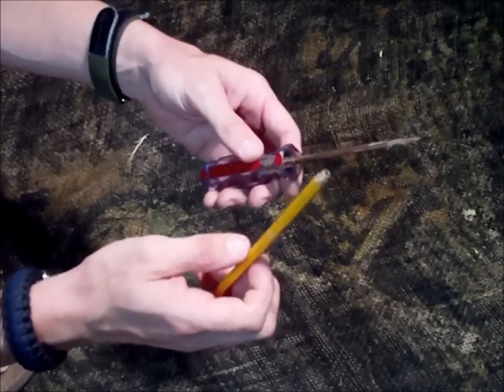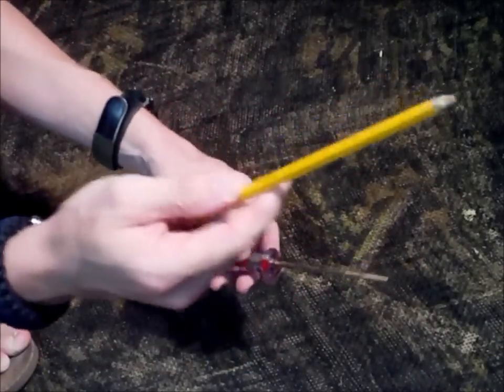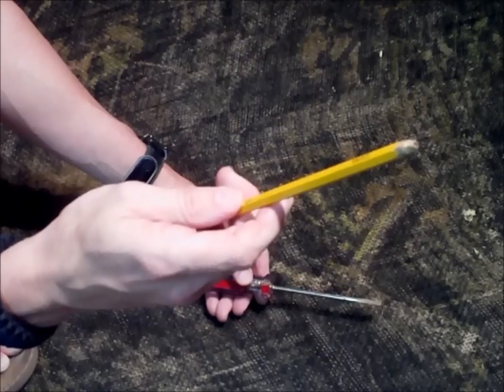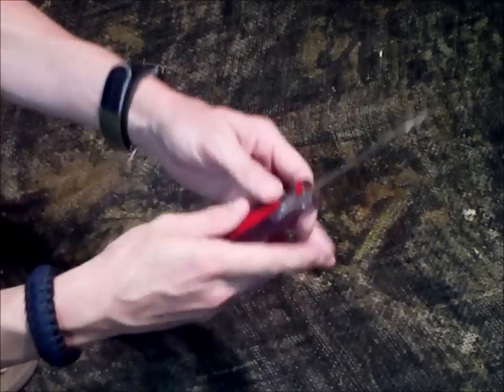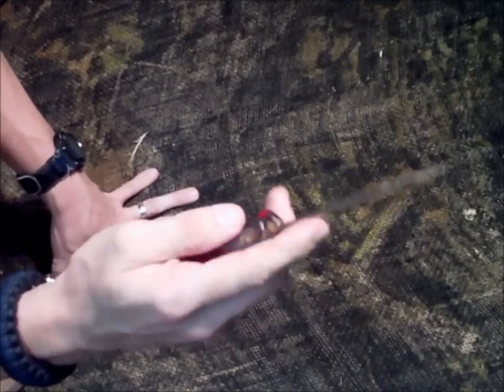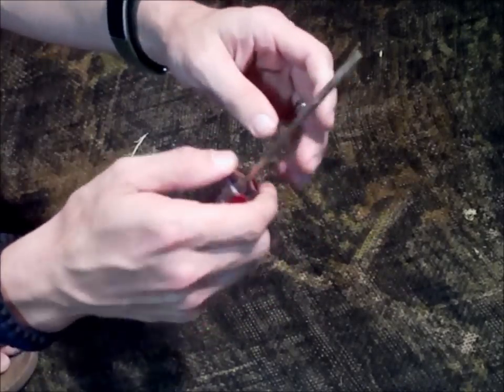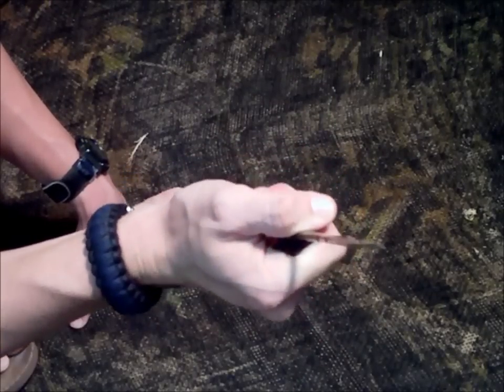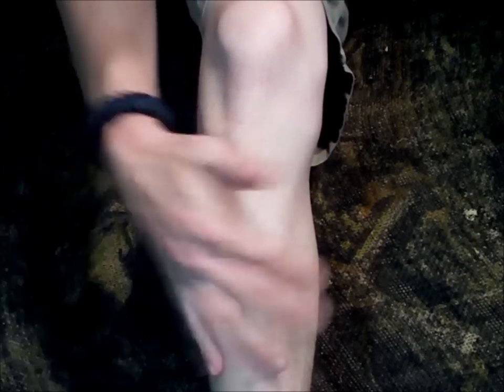The second thing you're going to need is a way to tighten up the material once you tie your knot — a windlass. A number two pencil is not strong enough for the pressure you're going to have to apply to stop the bleeding, so throw it away. You're going to need something hard — like this metal screwdriver. Something that's not going to bend or break as you turn it to apply pressure.